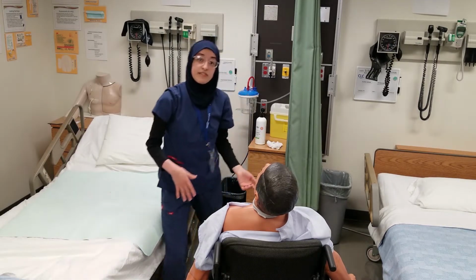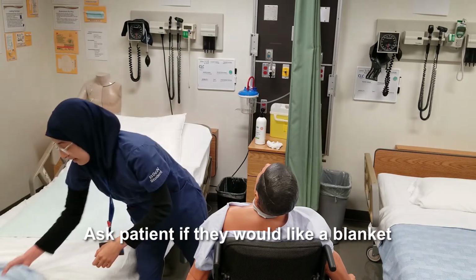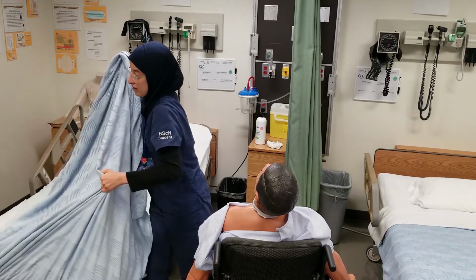And then I'll ask the patient if they want a blanket. Chris, would you like a blanket to go over you? All right, perfect. And I will just drape that on top.